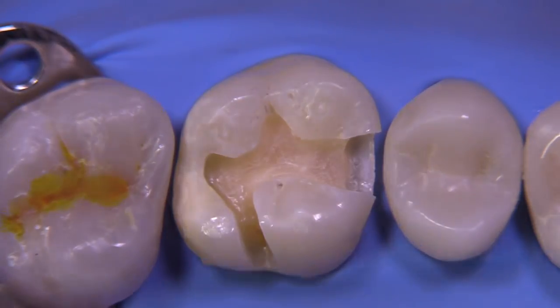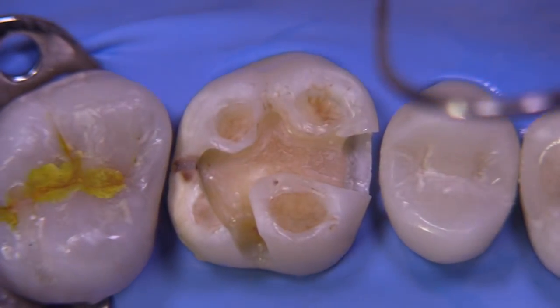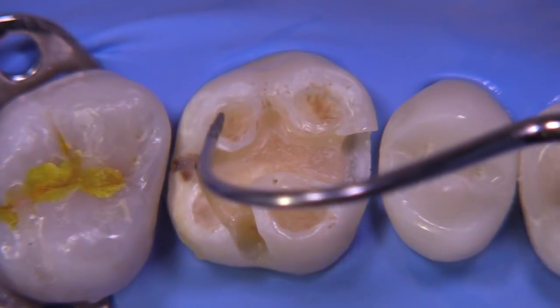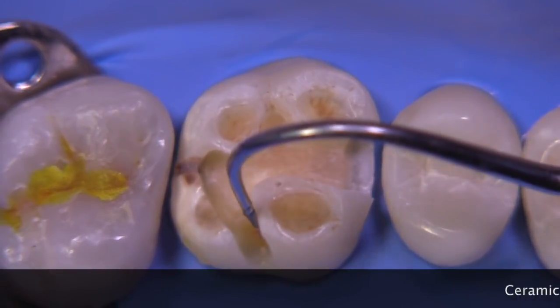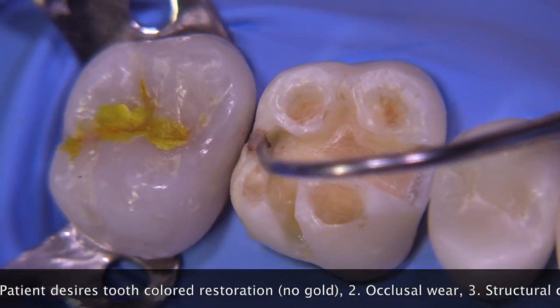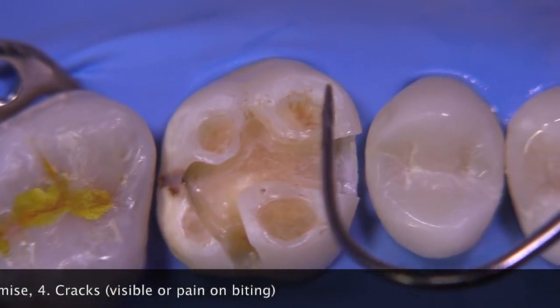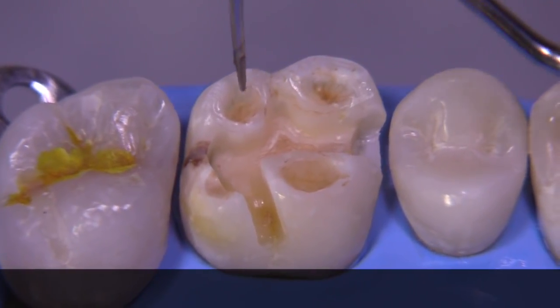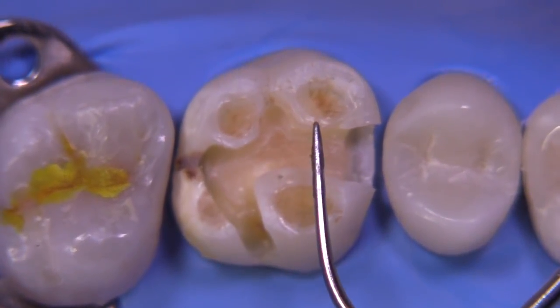At this point you could restore this with composite — it's pretty straightforward. But I want to transform this tooth into something different: a simulated tooth that would clearly be indicated for an onlay. Now you see quite a different situation — class 6 erosive areas on the occlusal due to wear and exposed dentin, a crack on the distal, a wider isthmus. The indications for an onlay include: the patient desires a tooth-colored restoration, they have occlusal wear like in this case, structural compromise where you're missing a lot of tooth structure, or cracks — either visible or with pain on biting. We can imagine this patient might have had pain on biting on that distal lingual cusp, which would clearly indicate an onlay.